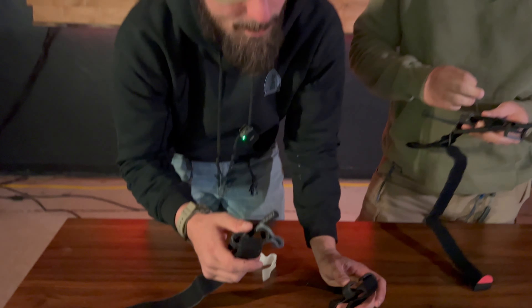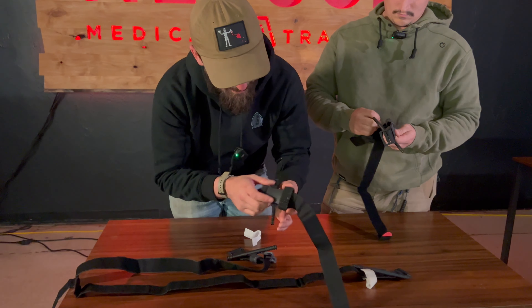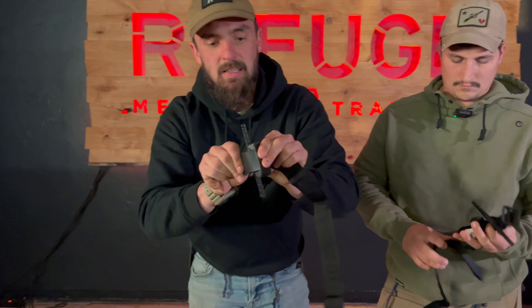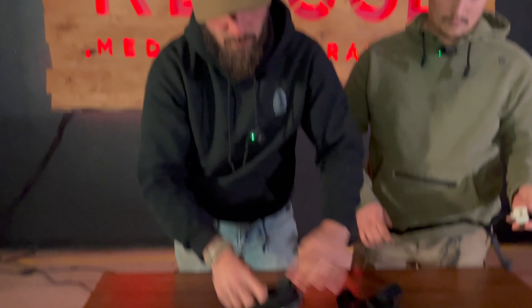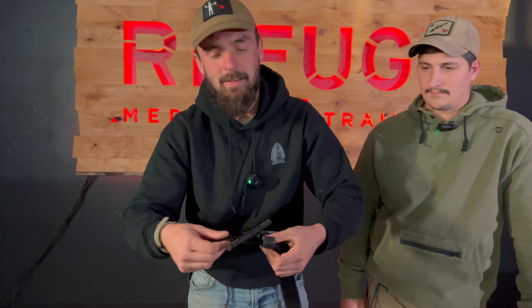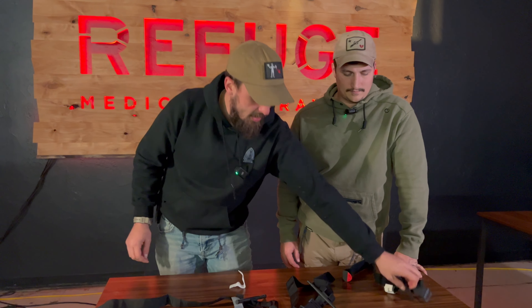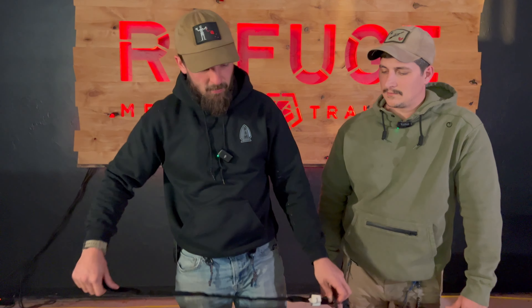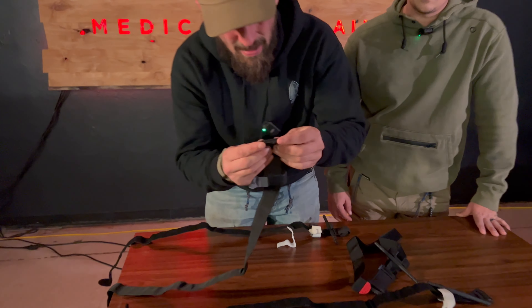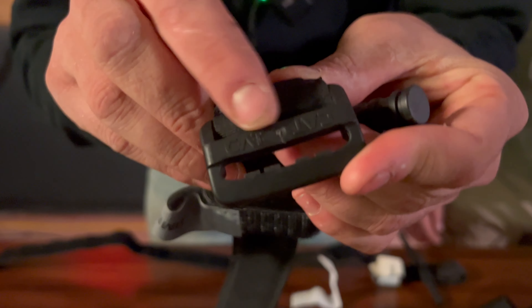We can do the same comparison with the C-clamp. The genuine one is a thicker, sturdier plastic — if I press it with my thumb I can get the fake to compress, but I can't really compress the genuine one as much. As for the plate, the fake just folds right over, whereas the CAT has more rigidity and is a better-molded piece of plastic.